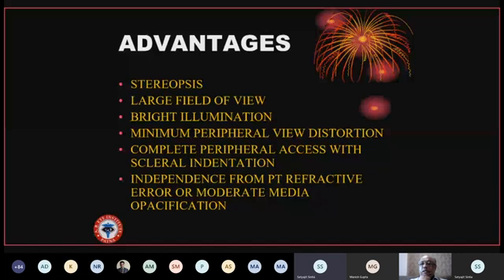Pooja, hold on here. There is a nice question from Dr. Shoigoto, which says, do we need a regular scleral indentation or only when we suspect a finding? I appreciate your question, Dr. Shoigoto. I will answer your question from your question itself. How will you suspect a finding if you don't do scleral indentation? What I mean is, if there is a lattice very near the ora, you will not suspect it unless you press and see over there. So that is one part of the answer.